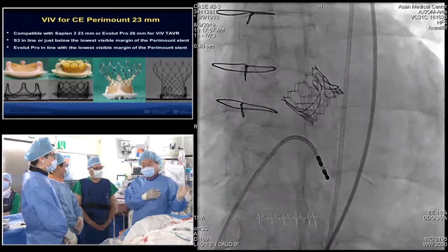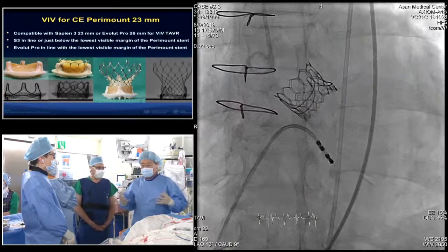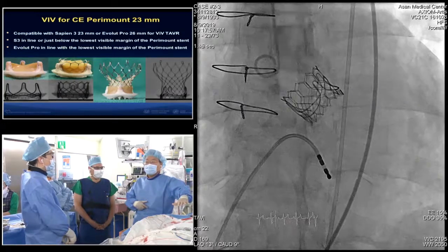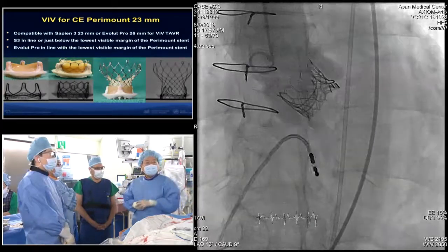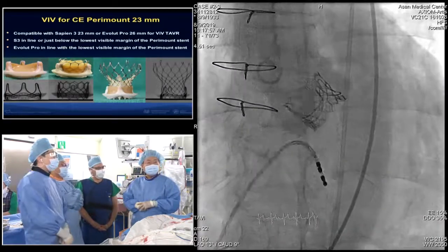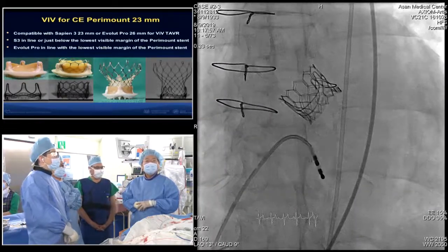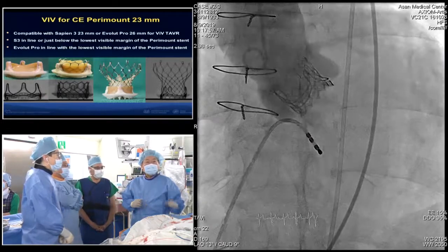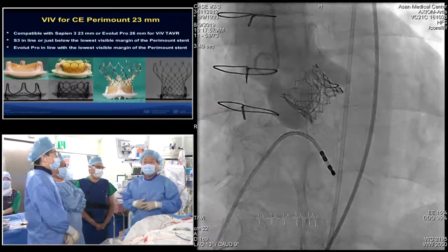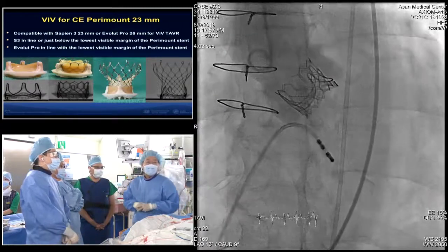Anyway, the patient is old, complained of dyspnea, and at admission in our hospital it was a kind of heart failure. So admission was to the CCU first, and then he got better. And we want to plan this procedure. Yeah, I think this is a pretty typical presentation. I remember the chest X-ray was near normal, no pulmonary edema and no cardiomegaly at all. For the live case, he was admitted for almost 1 more week, and getting better. Right. Okay.